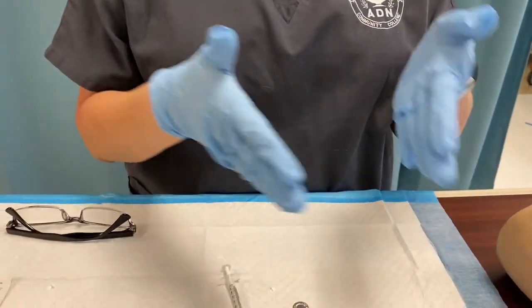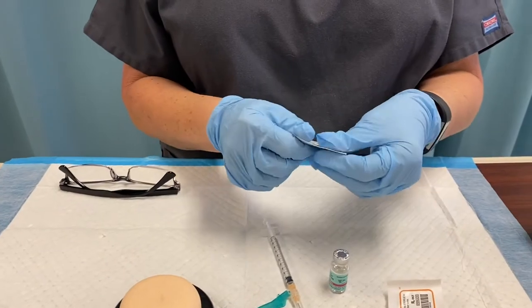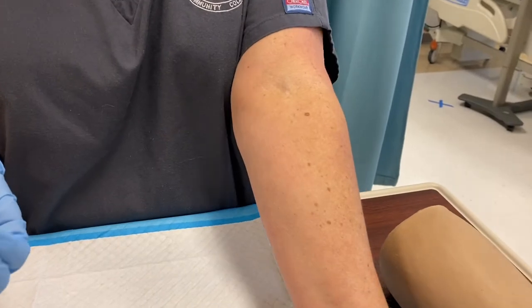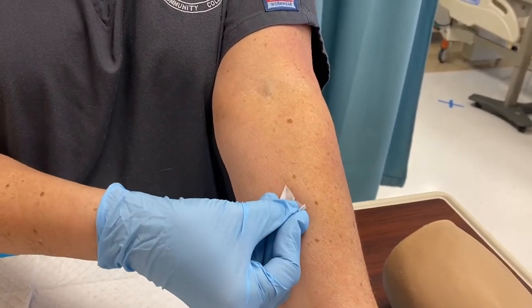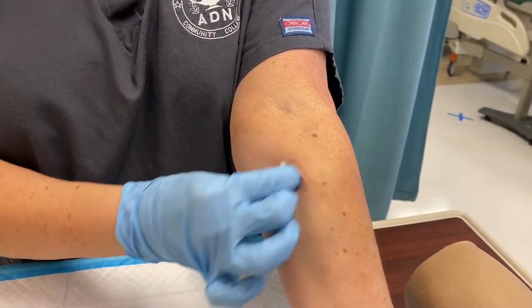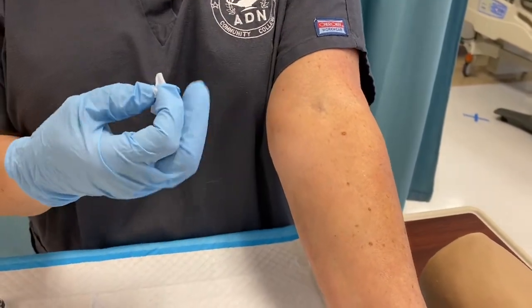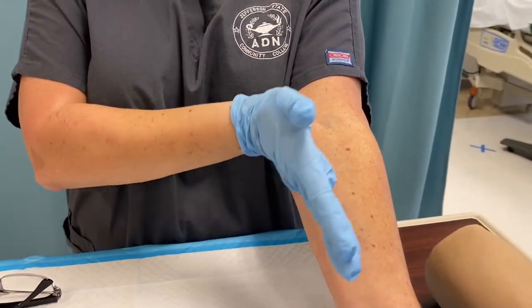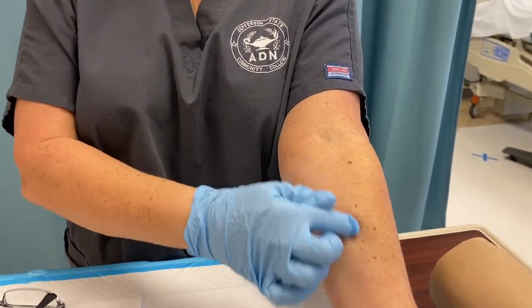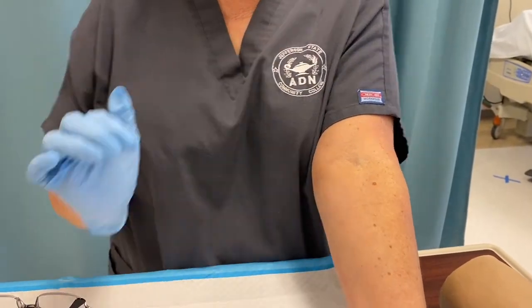Anytime with the intradermal, sub-Q, or your intramuscular injections, you're going to take an alcohol swab. You always clean from the center out in a circular motion. You don't want to ever fan a site — you want to just let it air dry. You never go from the outside in because if you do, you're just moving debris to that center part where you're going to actually do the injection. Always from the inside out.